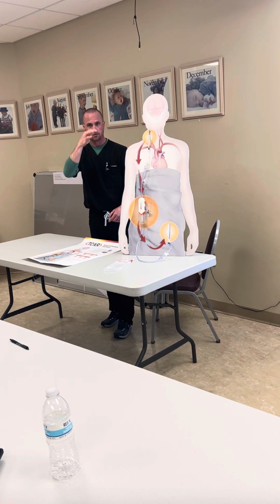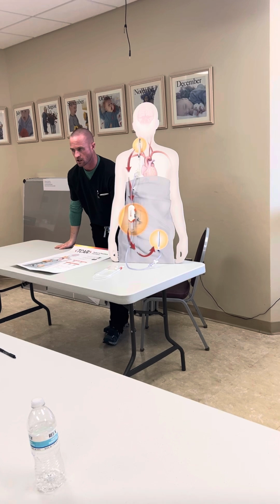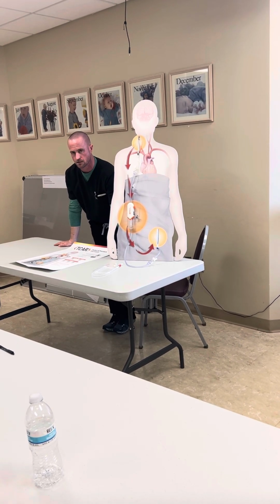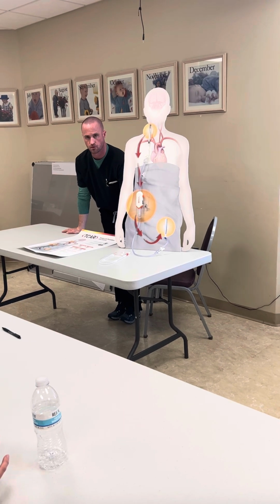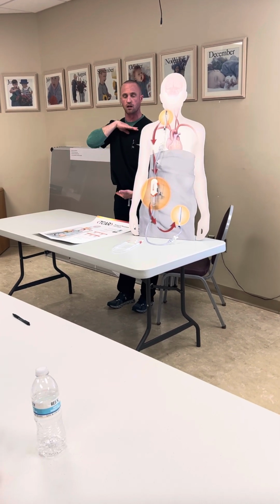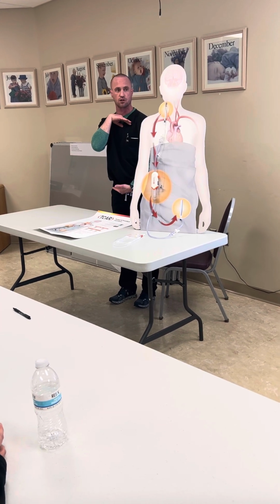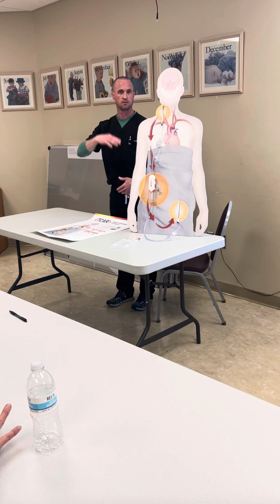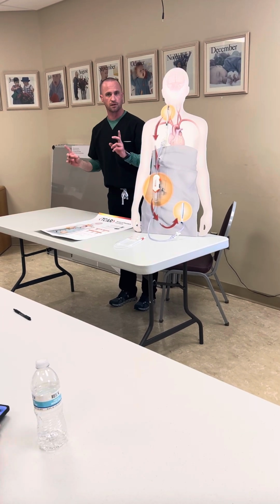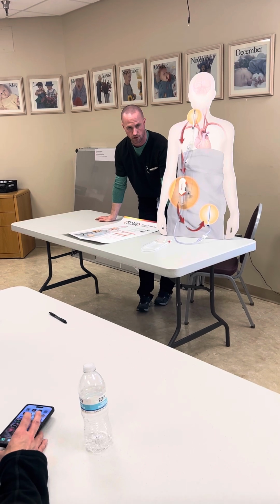Is it okay to use a standard table for this if we don't have radiolucent available? Usually, yes. Just move the base of it as far down as we can. Okay. As long as we can see. Occasionally he'll look through here just to be sure he's got venous access, because for some reason he's had trouble there. But 90% of the time, you just want to be here. Great. And we need to be able to swing pretty steep, LAO, RAO. Nothing usually more than maybe 35.